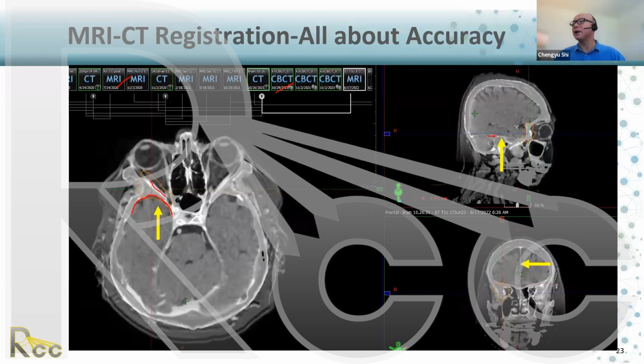And here is a feature point, even though it's further from the treatment area. And also, I like these lines. These lines are pretty good on both MRI and the CT. And if you can, also check those curvatures. You see the darkness, and those are highly variable on MRI and both CTs. So make sure you check those things also for the accuracy.